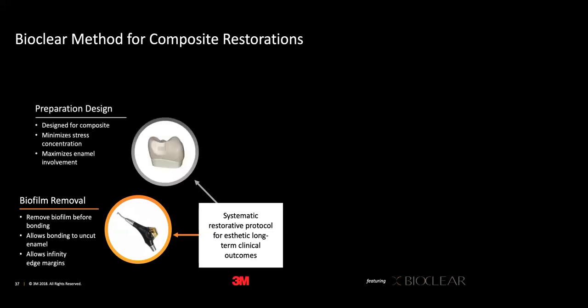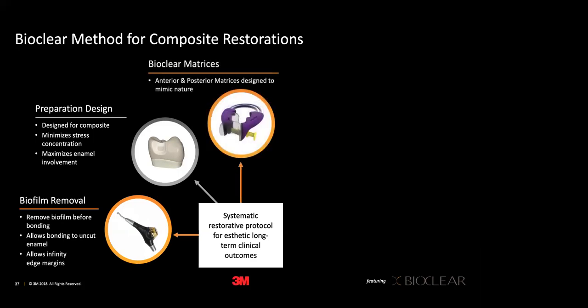And then the next thing is modern cavity preparations. This is the Clark Class 2, which we'd love to be able to help teach in the schools in India. It's the opposite of a GV Black prep. It's the opposite of a slot preparation. And that's a conversation that we're going to have at the next webinar when we talk about the Clark Class 2.